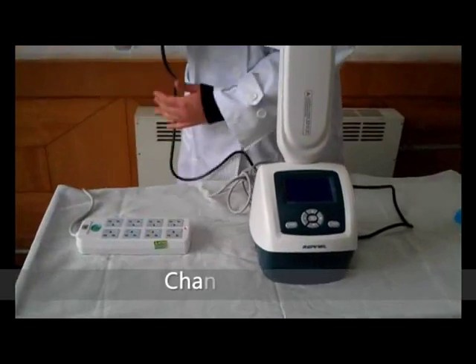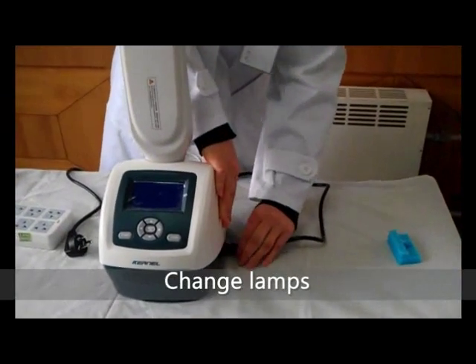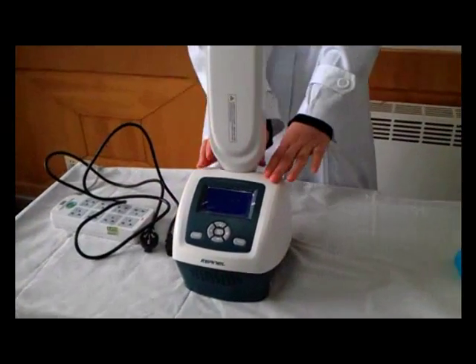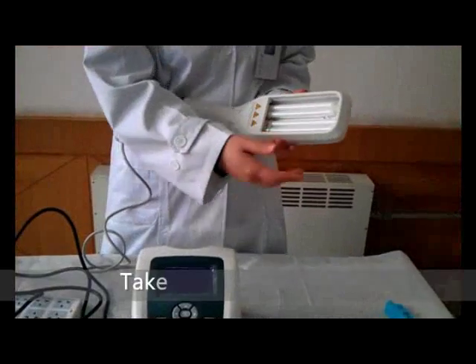Lastly, we introduce the replacement of lamps. Before replacement, please cut the power. The replacement lamps must be the same model. Lamps are fragile items, so please handle with care during assembling and disassembling.